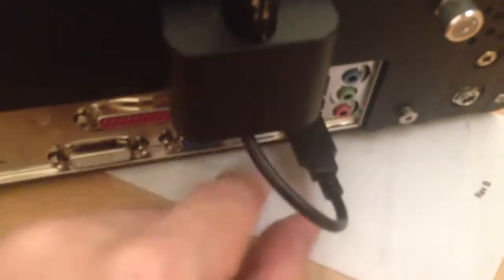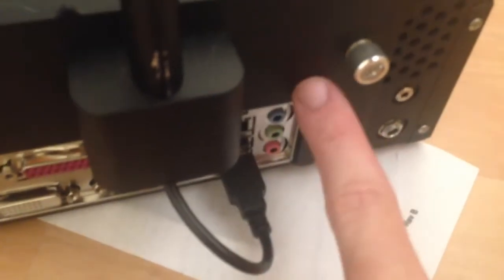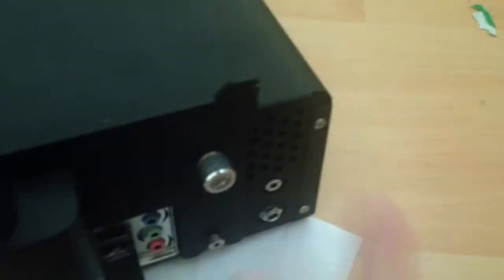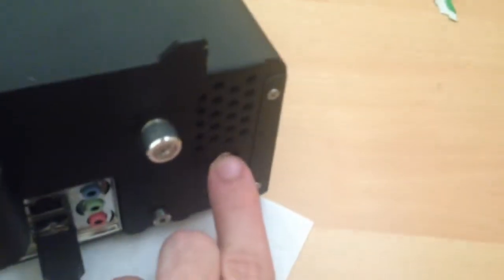Let's take a look at the back panel. As you can see, there's a lot of connectivity on the back. The camera is connected via USB. There are audio jacks — the ones in the middle on the motherboard itself are not used. The jack where I've got my finger is the one used for speakers.